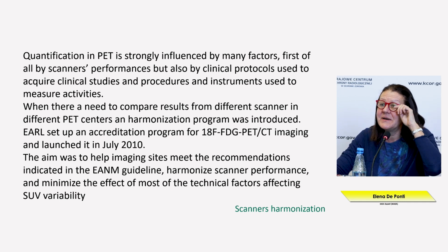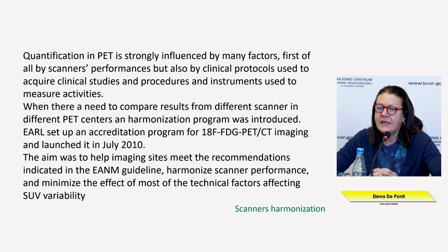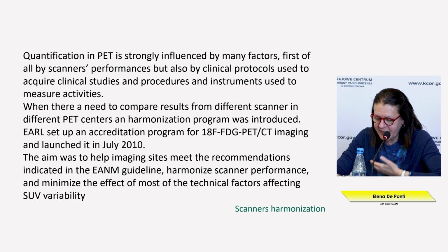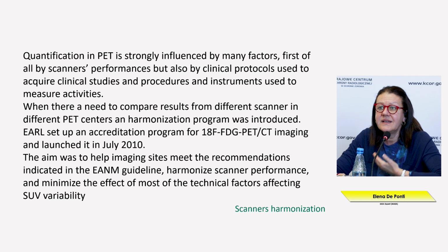And so we need a reference for harmonization of our scanners, in particular when we are going to use them in multicentric studies, as we want to compare results, and we don't want a patient scanned in one center to get a different result than if they were scanned in another center.